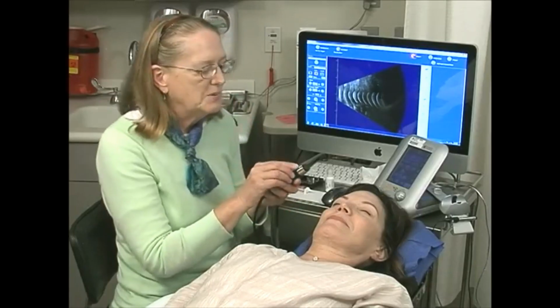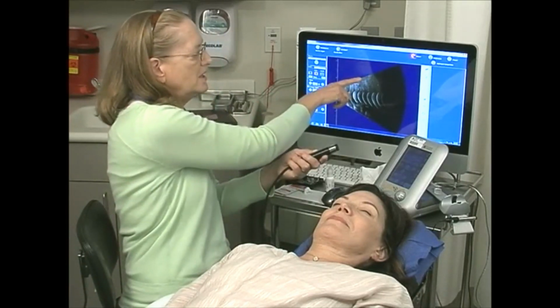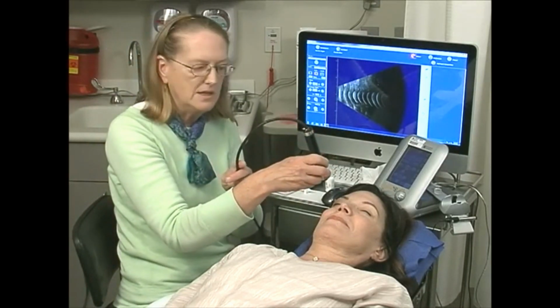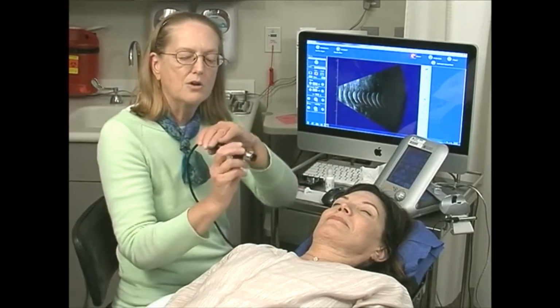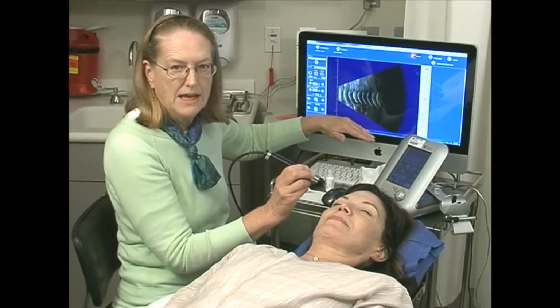It is a very important orientation. It explains to us where on the B scan the top of the screen is oriented to the mark. So that, for example, if the probe marker were placed nasally to do a horizontal scan, we would have a nasal temporal scan. If the marker were superior, it would be a superior inferior scan.